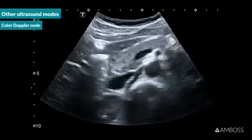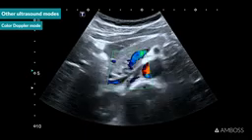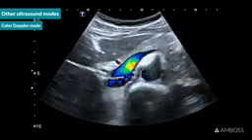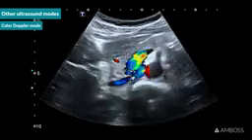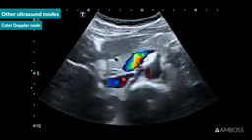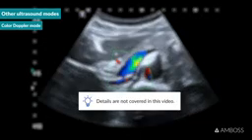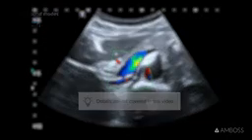Keep in mind that, as with B mode, Color Doppler mode has to be set up correctly to achieve the best results and avoid misleading findings. You can, for example, adjust the gain of the Color Doppler mode similarly to how you adjust the B mode gain, but the details are beyond the scope of this introductory video.